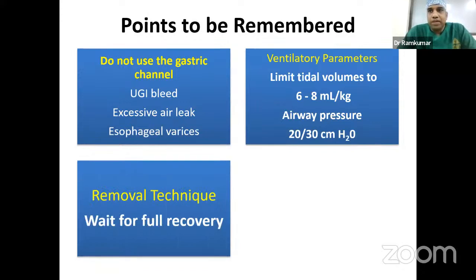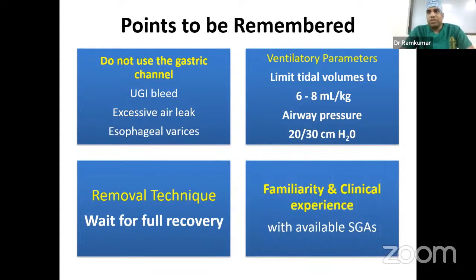And finally, the removal technique. It's better to always wait for full recovery, until the patient is conscious and any muscle relaxant used has been fully reversed, until the patient becomes very awake, because the patient can still tolerate a supraglottic device compared to an endotracheal tube. The final important advice is that there are umpteen devices in the market.